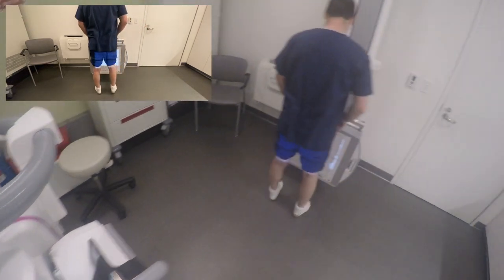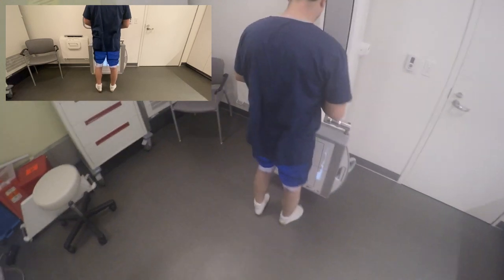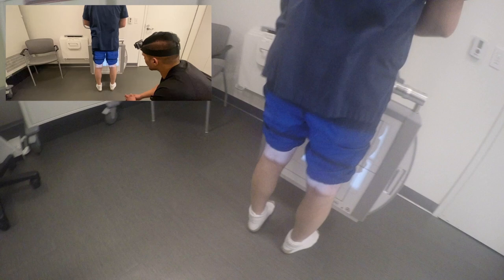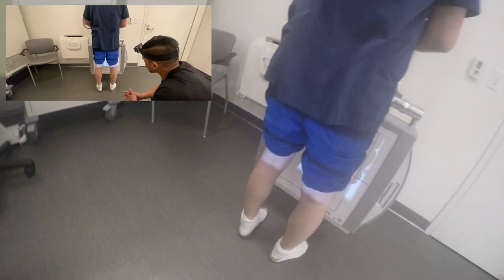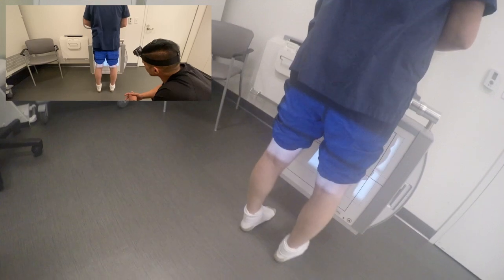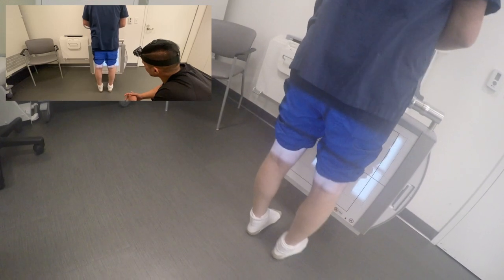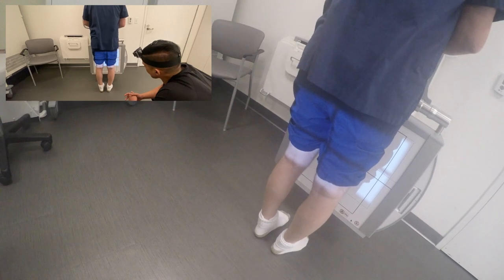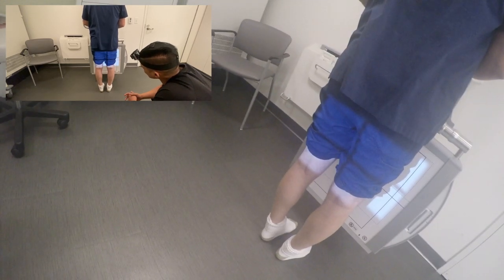Just like any other exam, my equipment is already in position — I just have to line it up to my patient. My facility's protocol for weight-bearing PA bilateral knees is 72 inches SID and 15 degrees down. For AP, the beam is perpendicular. My go-to ballpark technique is 80 at 10. Do not use AEC as it's difficult to have both knees on the cells.